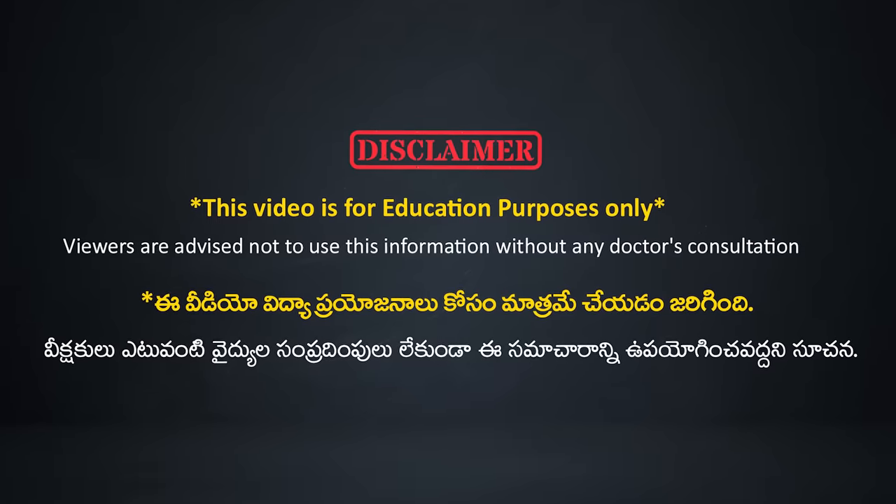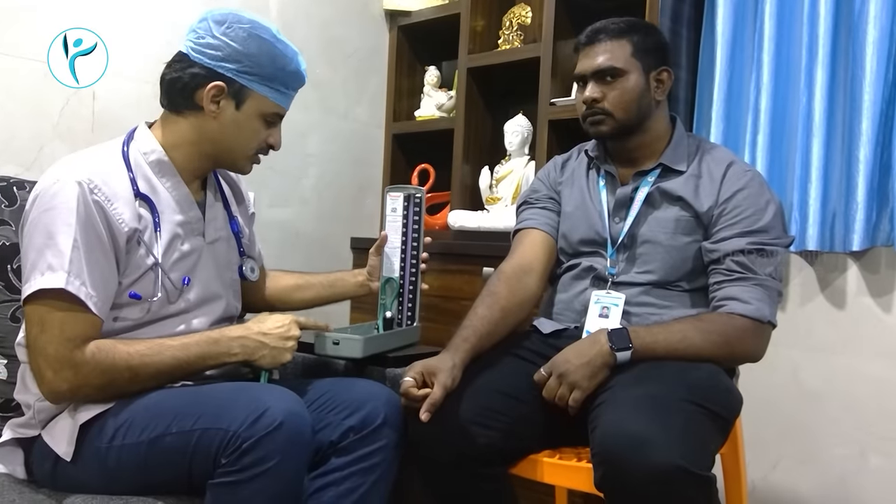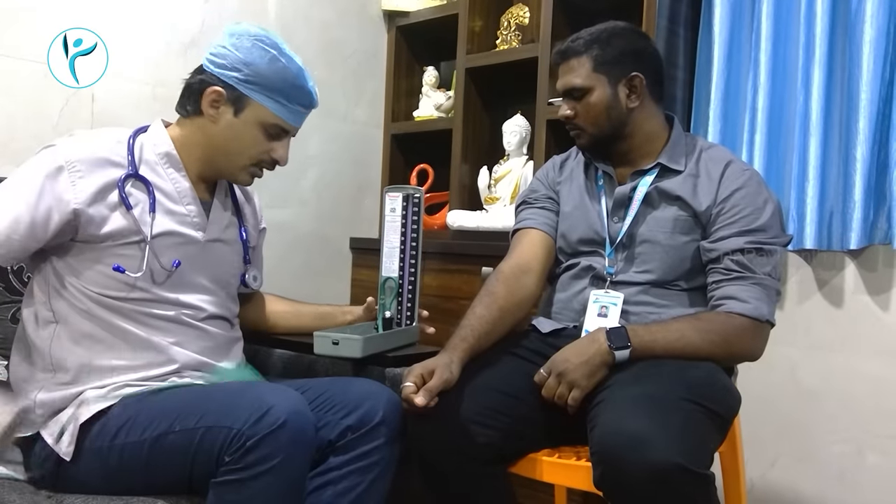How to make a manual BP? We are going to show this manual BP machine. This is a manual BP machine. It has mercury in the machine, and this mercury is used in the machine.